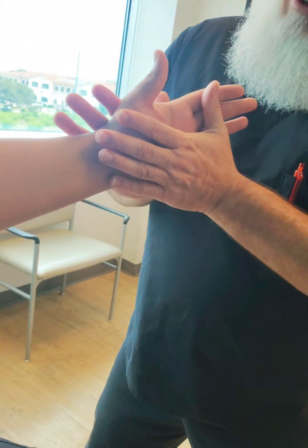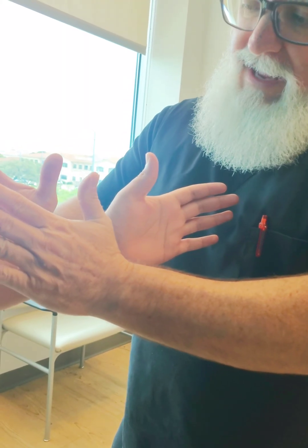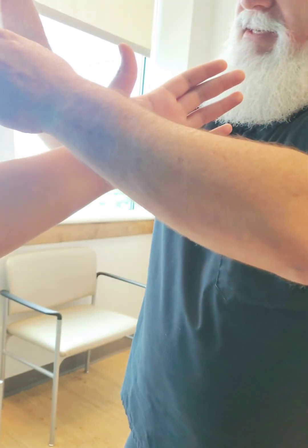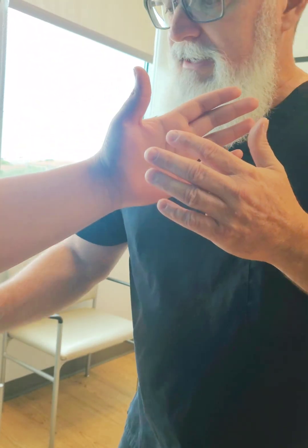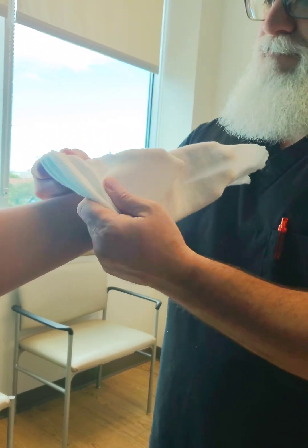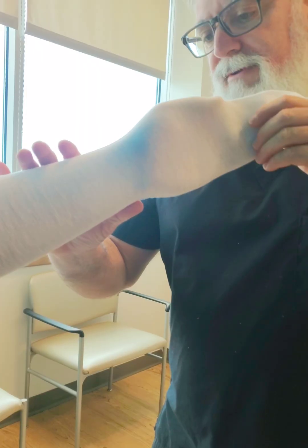The first thing to know when you're doing a short arm cast — or for that matter a long arm — when you're doing an upper extremity cast and the doctor has ordered an ulnar deviation, unlike the standard cast where you'd put the stocking net on and start rolling the cotton, what you actually want to do is get the patient, if they're able, and verbally ask them to drop at the wrist.